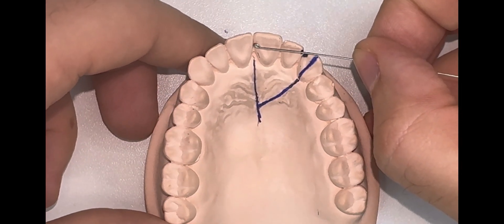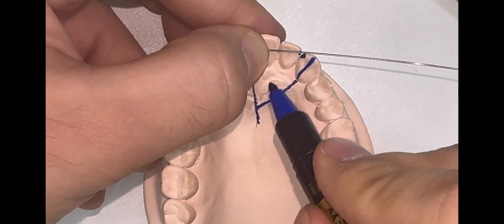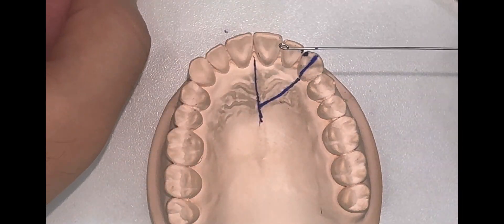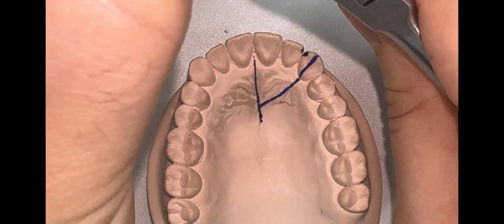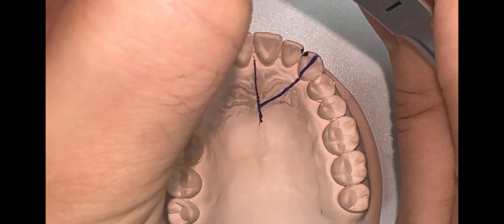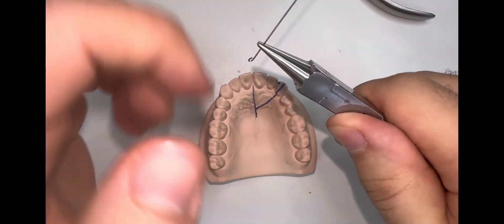Next, I'm going to mark the distal border of the Z Spring by holding the non-traumatic coil and with my pen marker I'm going to mark the distal part. Next, I'm going to bend my first coil of the Z Spring. Remember, the two coils should be opposite to each other. Therefore, in this demonstration I'm going to bend my first coil in the upward direction.